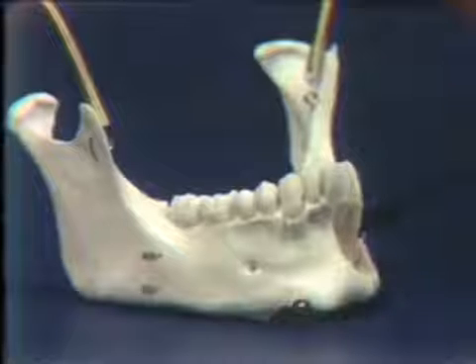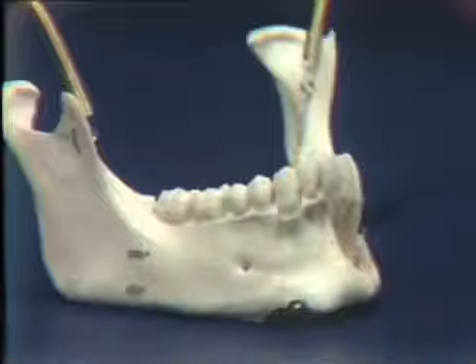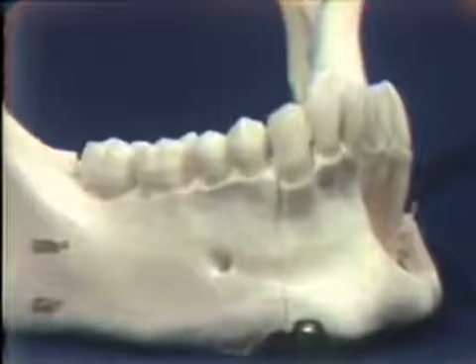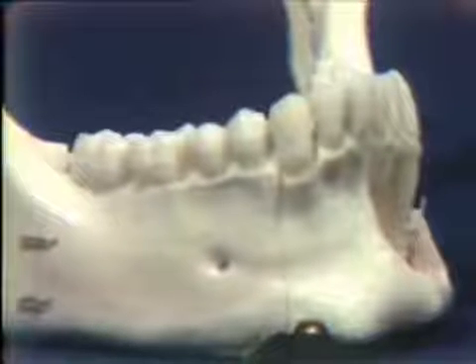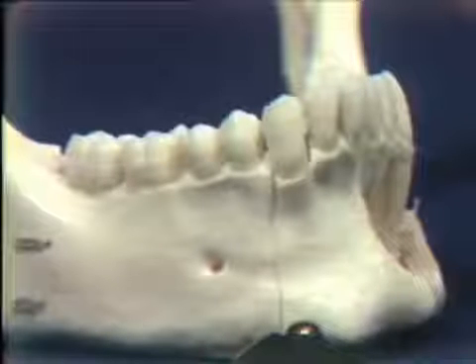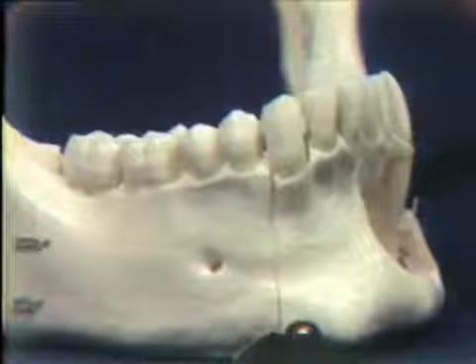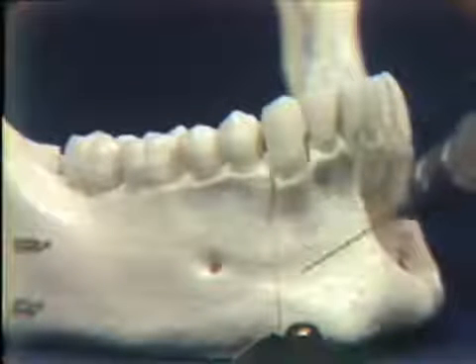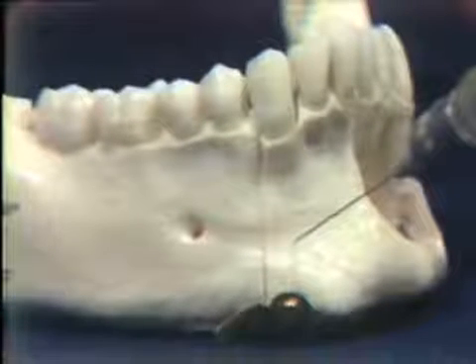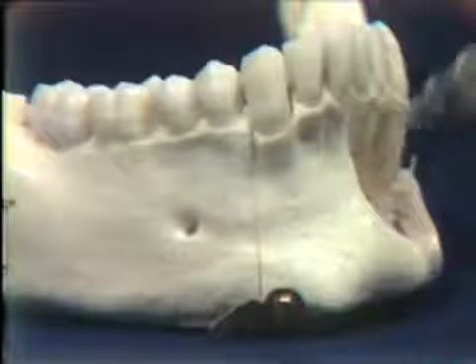Let us suppose we were going to infiltrate this lower cuspid. And let's remember that the cuspid root is a little longer than the other anterior teeth and the incisors. And our goal, of course, is to get the needle bevel against bone through the vestibule at a level of or slightly below the apex of this cuspid tooth in such a fashion as this. Needle bevel against bone through the vestibule, and then our injection is made. All right, let's go to the patient.